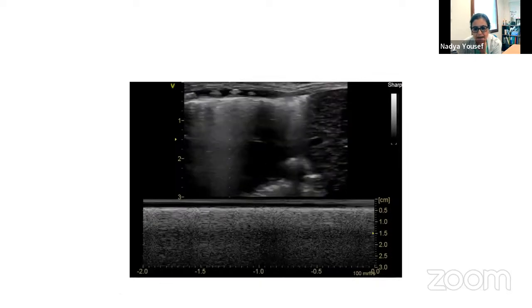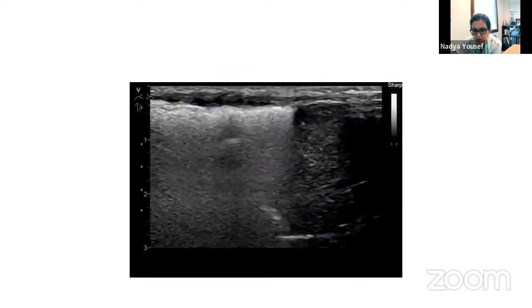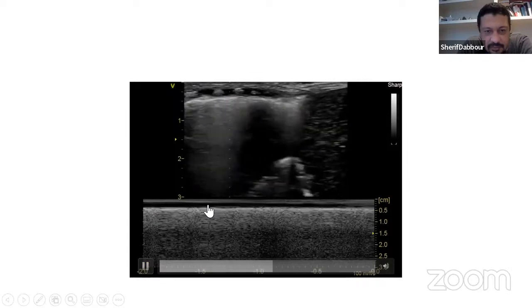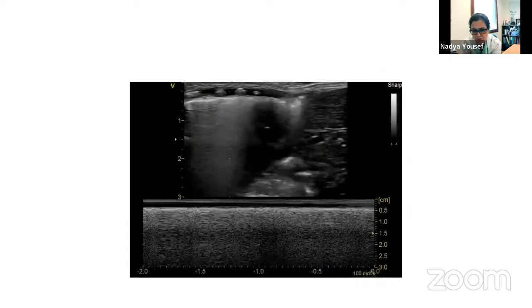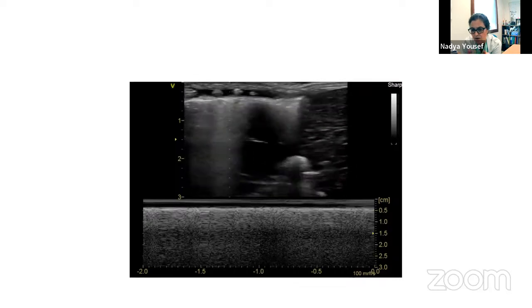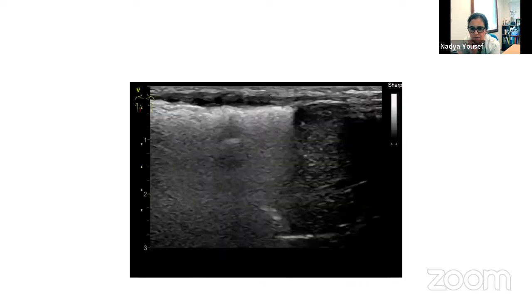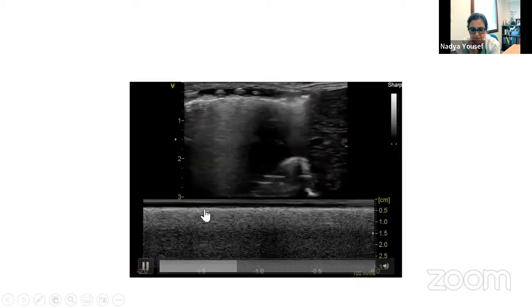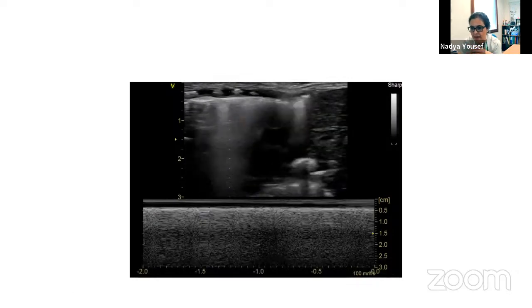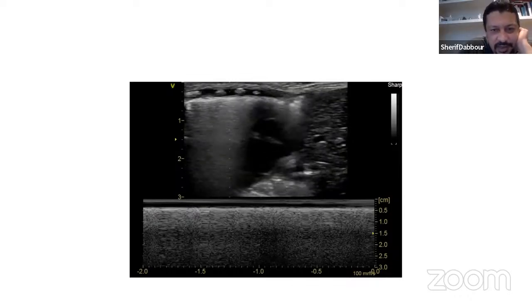If all your screen had been black with these parallel lines, that would have been a barcode or stratosphere sign. But you have a difference between the upper part of the screen, which is not sliding, with the subcutaneous tissue and the ribs. Oh, okay. And you've got the heart, which is why it's giving a little bit of pulse and sliding, but you've got movement. If there had been no lung sliding in this area, you would have had these parallel lines all the way down. You have a very small area with no sliding because of the way you've set the depth. If the pointer area had gone all the way down the screen, that would have been absence of sliding. Okay, so do you mean because of this area, this black area?